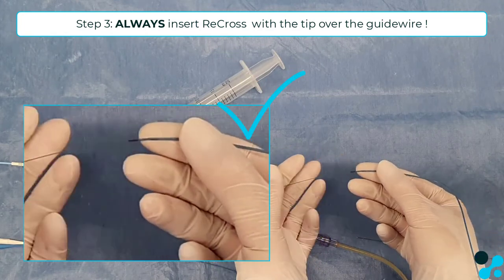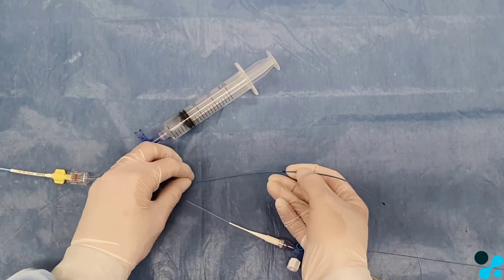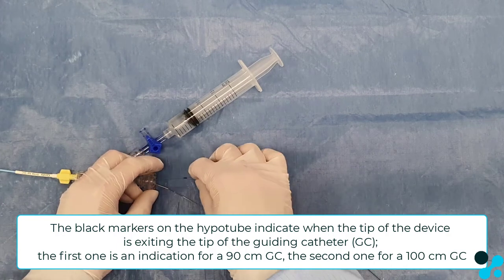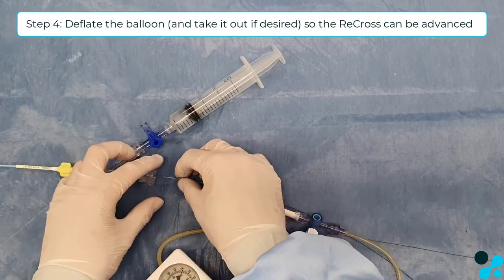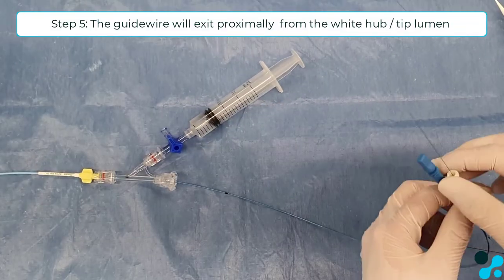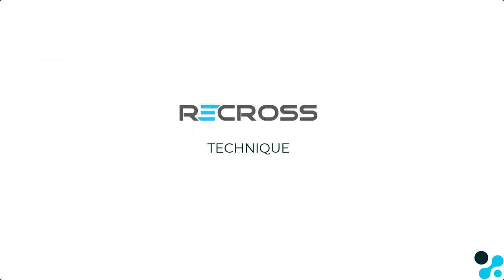Follow the Recross with the tip over the guide wire. The black markers indicate whether the tip of the Recross device is exiting the tip of the guiding catheter, either the 90 cm or 100 cm guiding catheter. Deflate the trapping balloon again and take it out. The proximal end of the guide wire is exiting from the white tip hub, as you can see, and advancement of the Recross device can be continued.